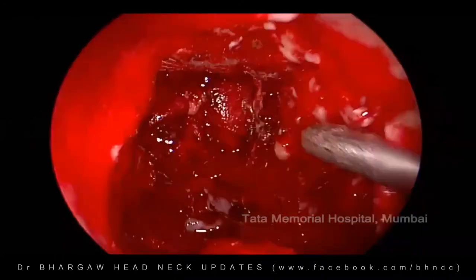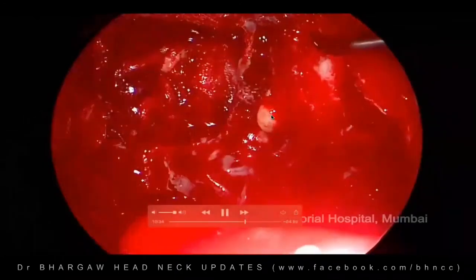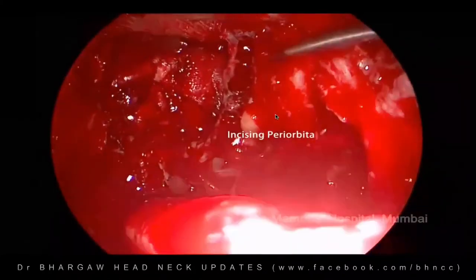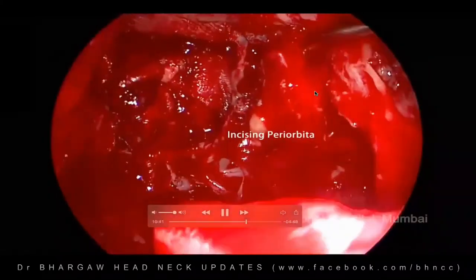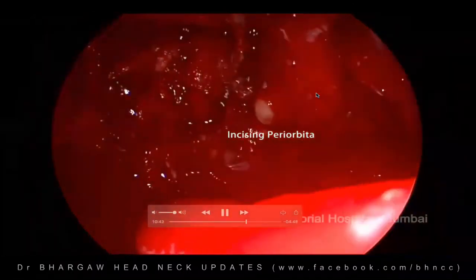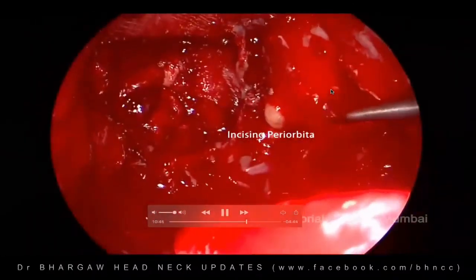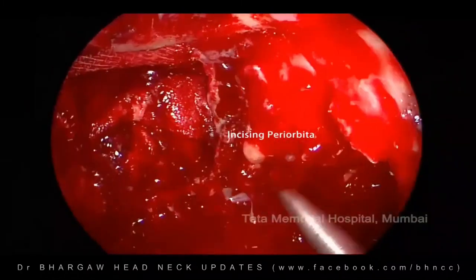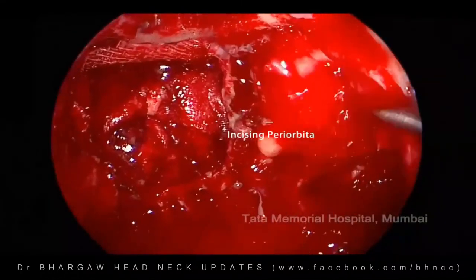subsequently. Because if the fat pops out like this, if it is more than this, then it will be very troublesome to handle. So we now incise the mucosa here, the periorbita here, and remove that along with the fat, because if this comes free, the fat is free of disease, then we don't have to do an exenteration for this gentleman.